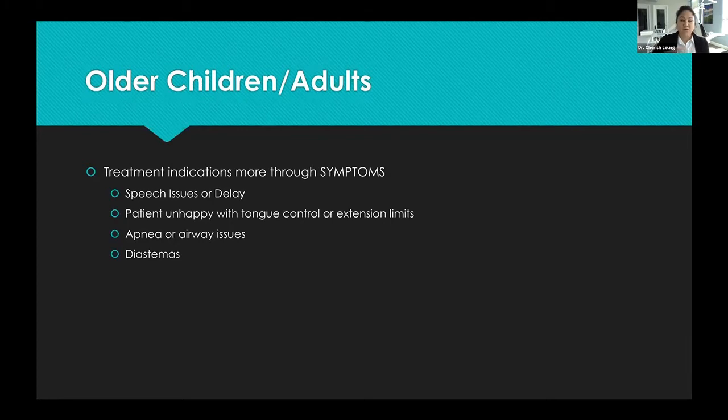And then on the older toddlers, if they're not able to sit for it, on their first visit, I always ask the parents, are they having speech issues? Do they have any delay? And if they do, then I make them do the knee to knee, and I check it that way. So you want to look for that speech issues and delay, because sometimes on these 3-year-olds, after we do a release, they come back in there for their week checkup, and they've seen the speech therapist, and they're a whole different kid. Or a couple months later, they'll have an explosion of their lexicon because they're just able to speak now, so they can say so many more words. And it's really amazing when those kind of things happen.